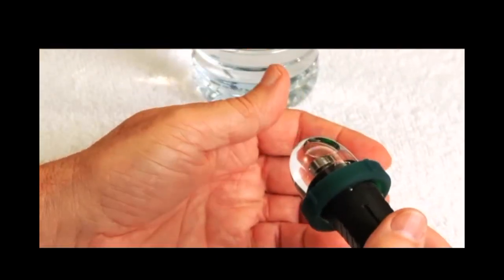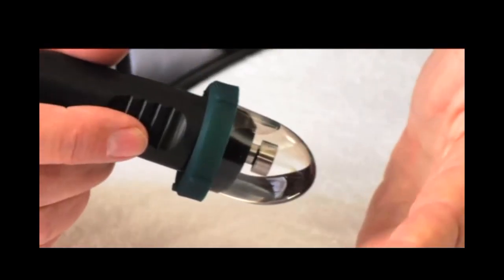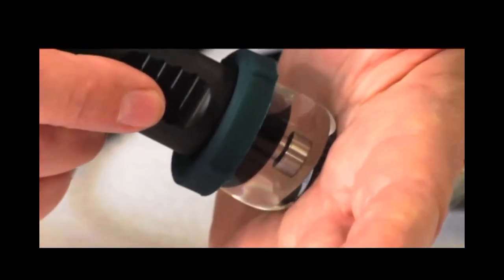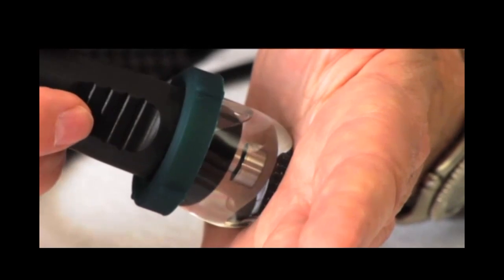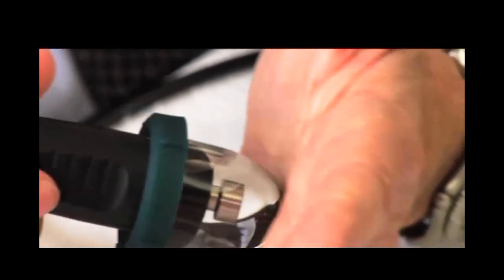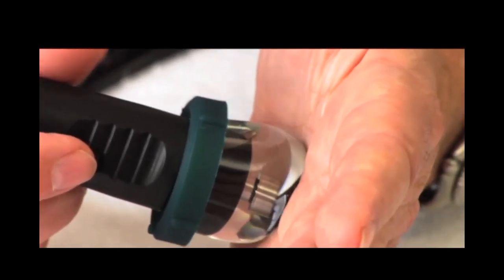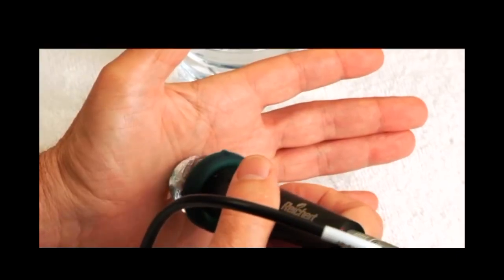Once you insert the probe into this bag, it's no longer a flaccid bag with zero pressure in it. It's pressurized, just like the pressurized tire of your car holds your car off the ground. This is holding this away from the eye. So this gives you a safety feature because the more you push, then the more resistance there is in coming back. And if you look at your screen, if you see it's getting very close to the top of the screen, then you know you're probably pretty close to the cornea. But because of this feedback feature, it provides an important safety factor.